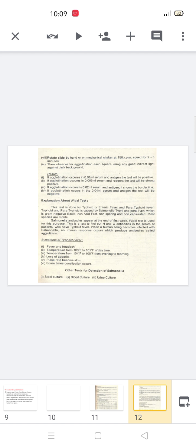Now we discuss with you the lab diagnosis once for the salmonellosis. Here we can say the stool microscopy as well as culturing of the vomitus and the stool.